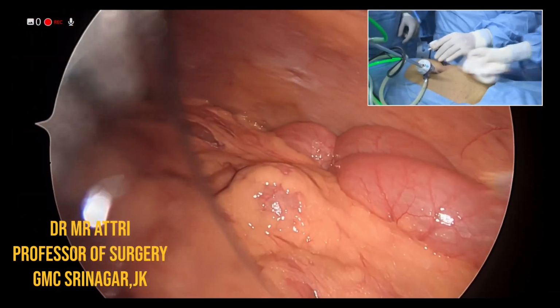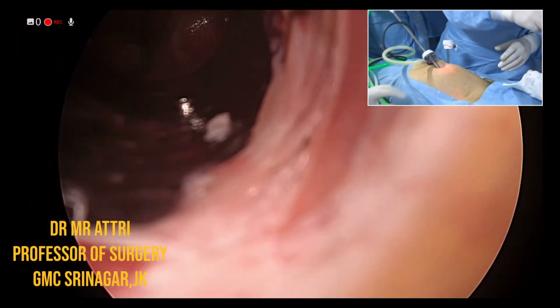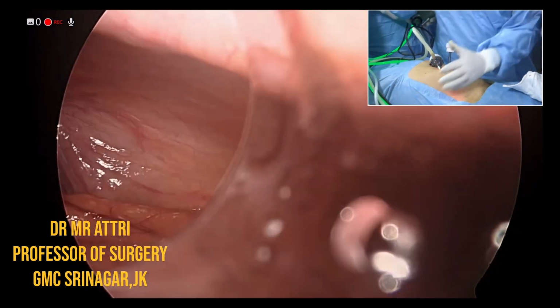Directed towards the pelvis. Can I have somebody from the audiovisual team?